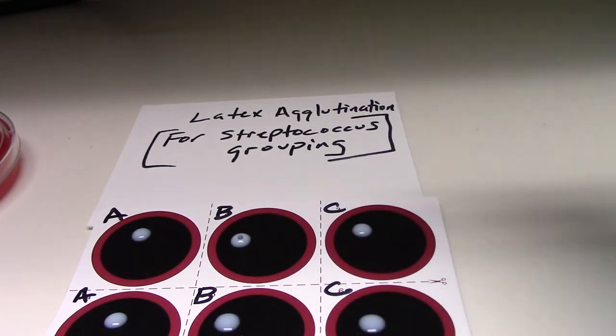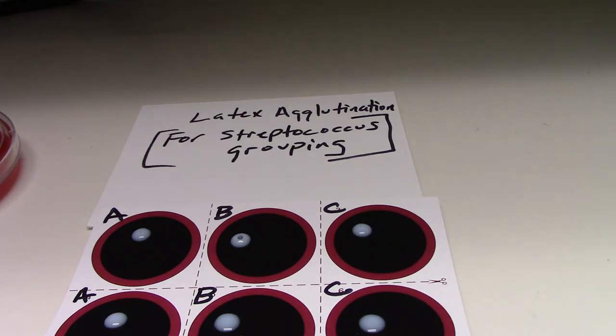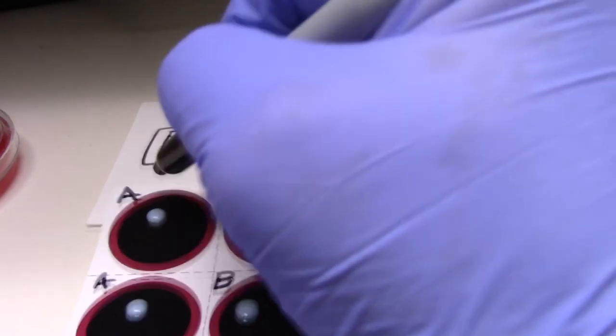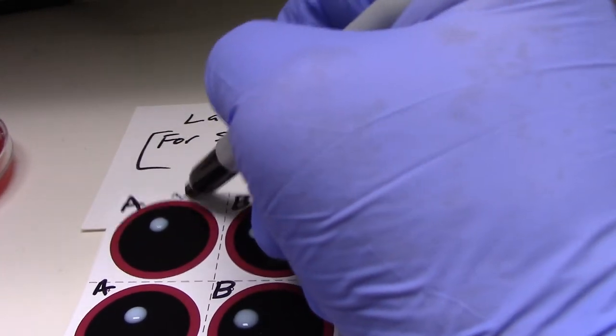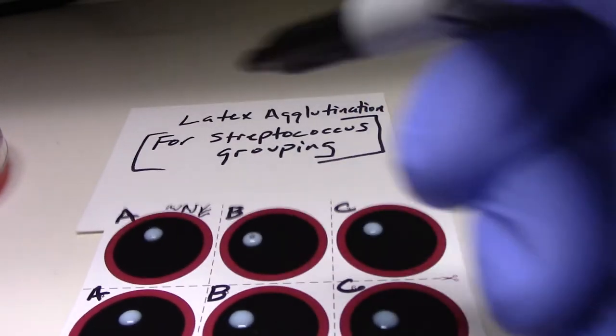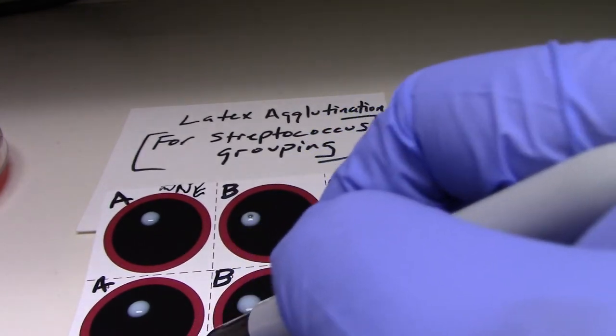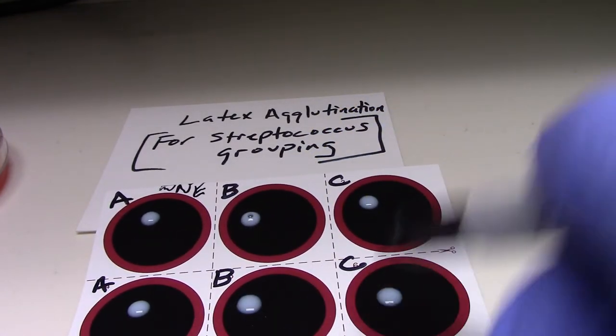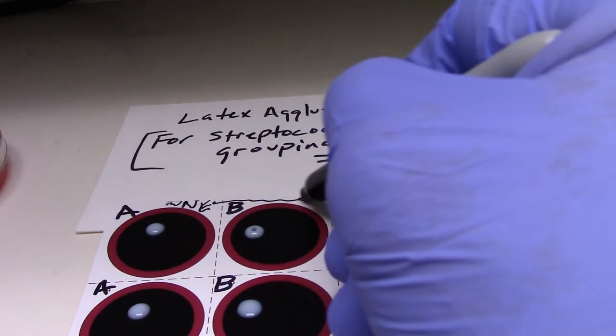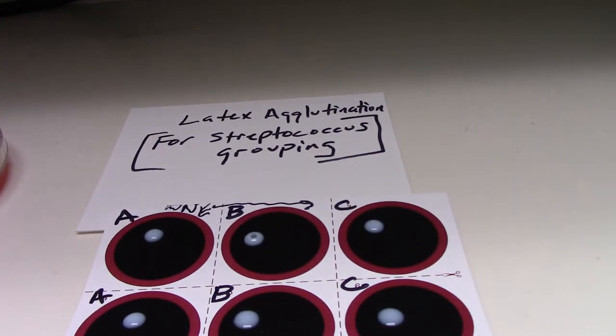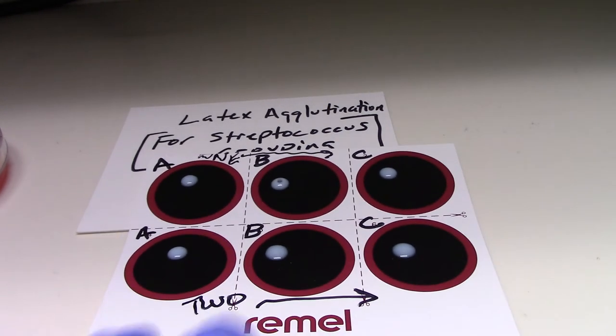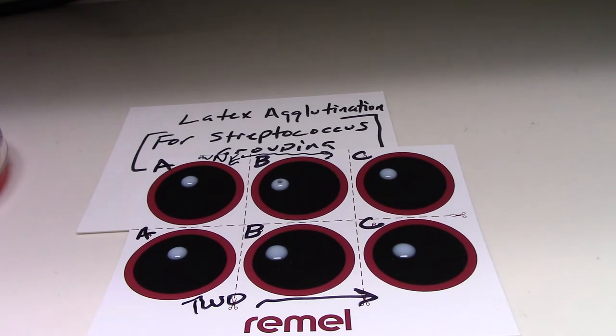So we have two specimens. Specimen 1 will be at the top, and specimen 2 will be across the bottom. And we're testing A, B, and C with number 1, A, B, and C for number 2.